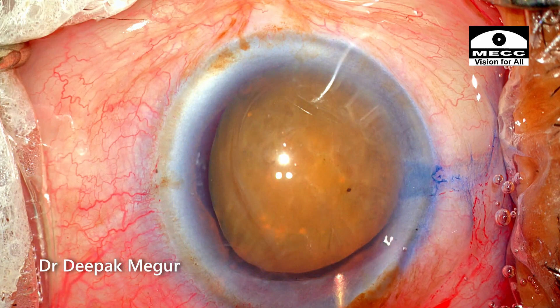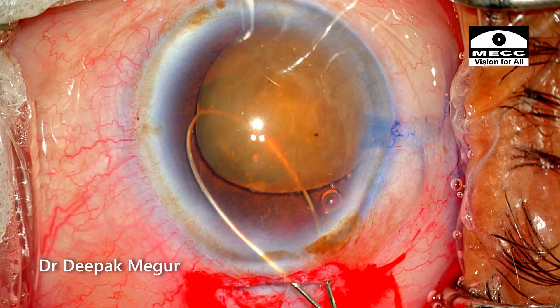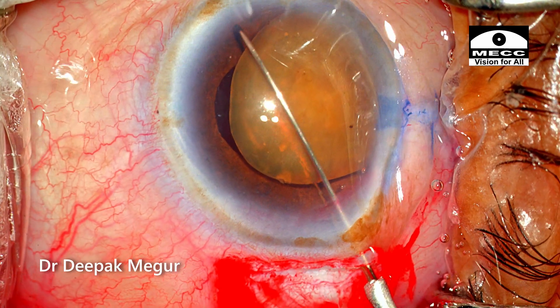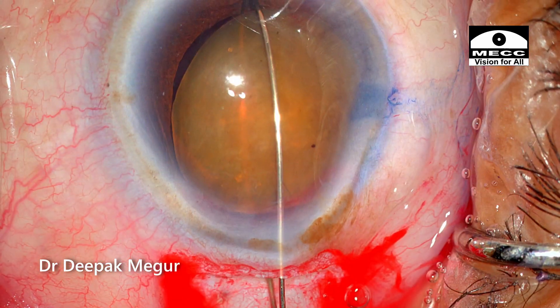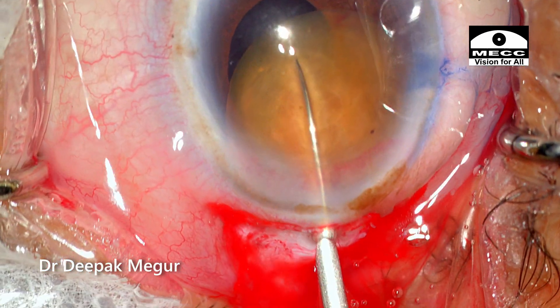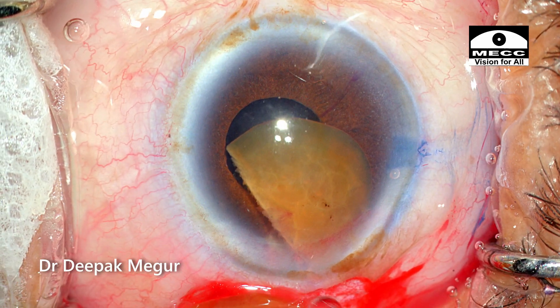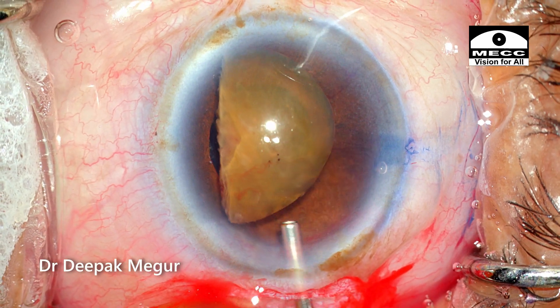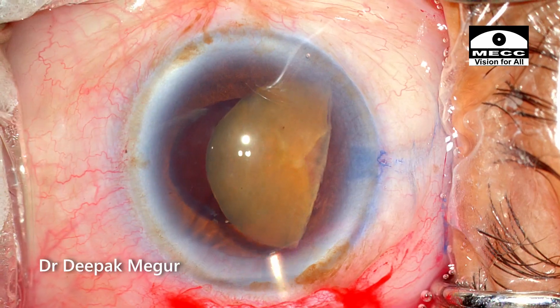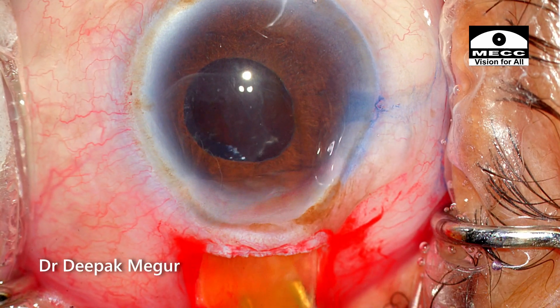The nucleus is suspended in a cohesive OVD. The snare is slanted as it is introduced into the anterior chamber and then the loop is flipped to engage the nucleus. Once ensuring that it is at the center of the nucleus, the strings are pulled to bisect the nucleus. Incidentally, one of the hemi-nuclei has just expressed itself out. The viscoelastic is reintroduced into the eye to ensure that the remaining heavy nucleus is centered. It is then held between the two prongs of a McPherson forceps and pulled out of the eye.